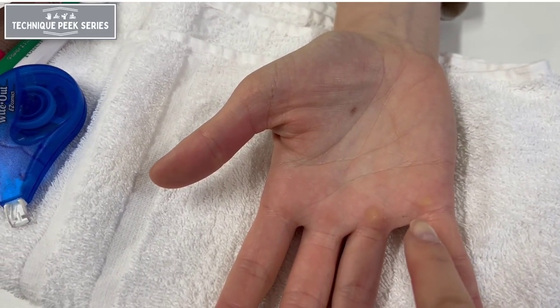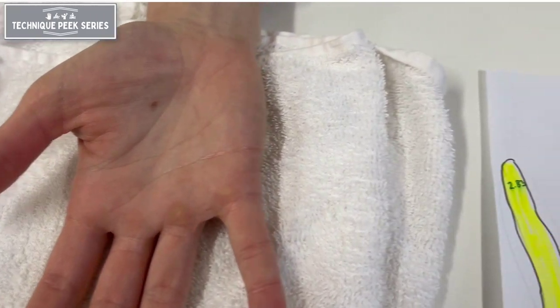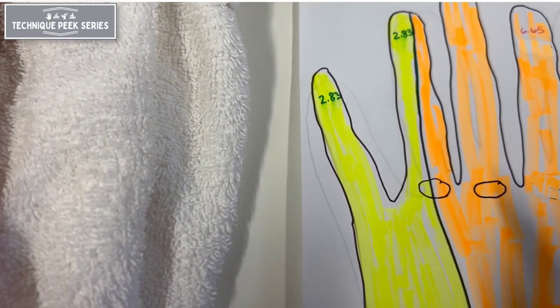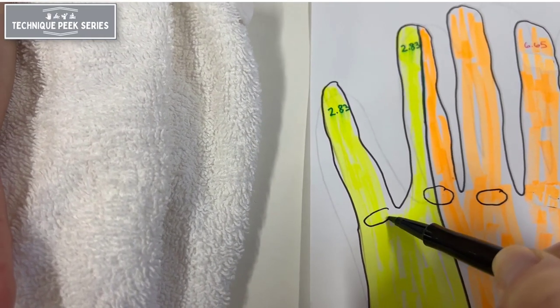One other thing to note is if the patient has any calluses or dry skin on their hands, these are not areas that are best to test because they would have decreased sensation. You'll want to mark those areas on your chart.